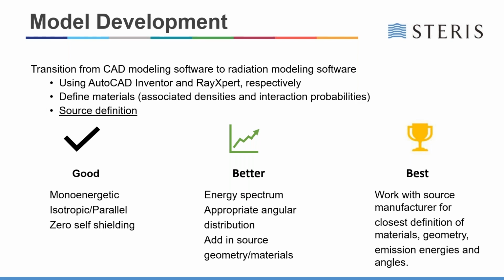And that is because the sources will change over time, and even minute changes can impact the simulation results. So here, that relationship with the source manufacturer is something that really separates a simulation provider being able to have that information and produce a repeatable foundation for simulation that can be used going forward.